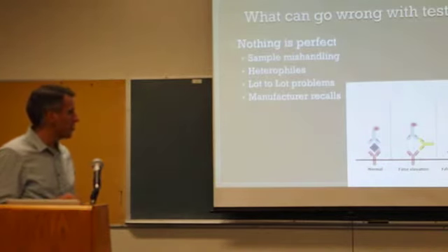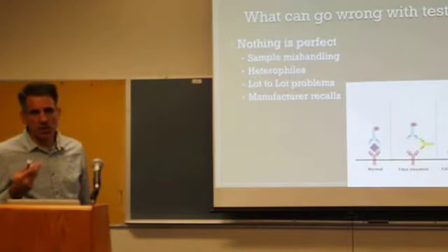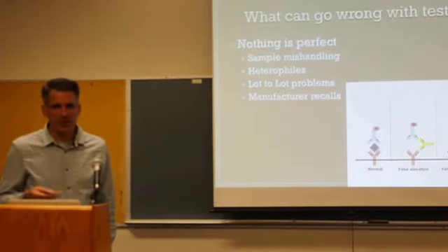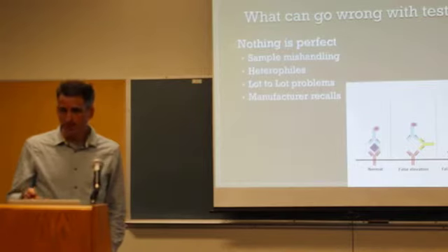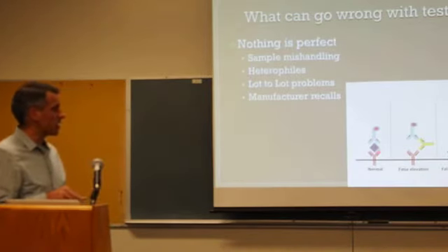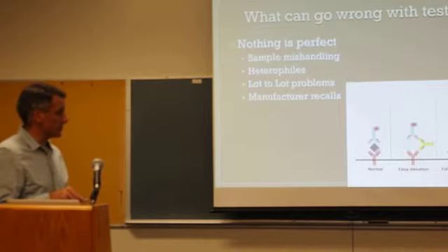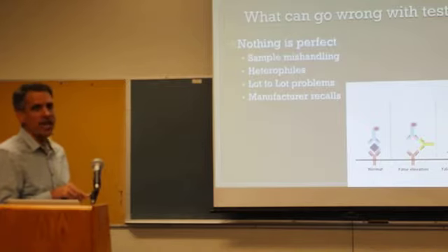And that occurs when, believe it or not, if somebody happens to, let's say, this is one of the ways, if you've had a rabbit farm or if you had rabbits as a kid and you develop antibodies against rabbit, then if those antibodies are floating around, you can connect this, what we call the capture antibody and the signal antibody, together without the IGF-1 or growth hormone sitting in the middle.